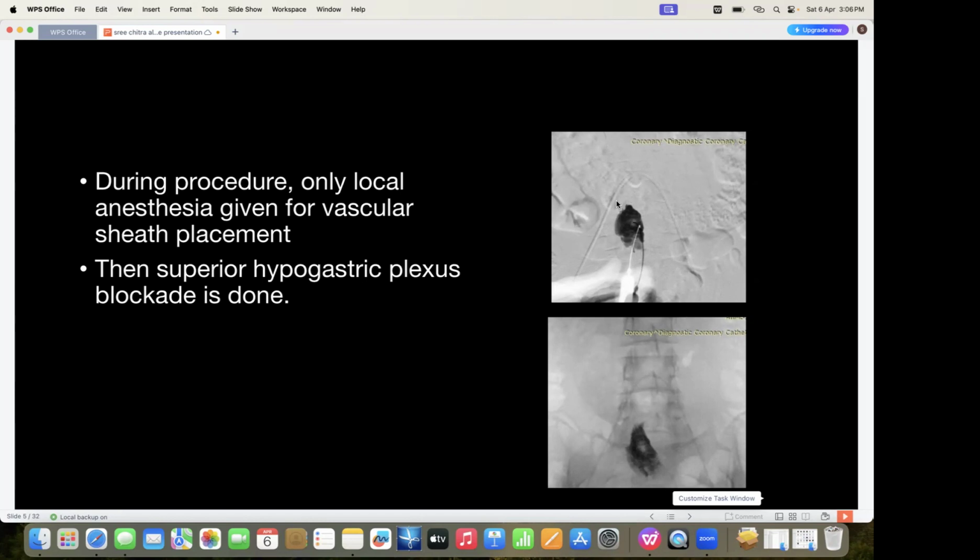So we select the L5 vertebral body, at the mid to slightly inferior level. You can see the Chiba needle is placed at the inferior aspect of the L5 vertebral body, so that this position is relatively devoid of vessels, both arteries and veins, but still in the upper aspect of the L5 vertebral body.